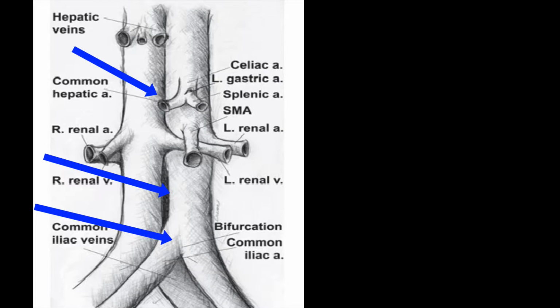Now notice I said nearly 100% sensitive for ruling out AAA, or abdominal aortic aneurysm, not dissection. Ultrasound is not the test of choice for aortic dissection. For that, you need a CT, or computed tomography. The exam itself consists of 3 cardinal views.